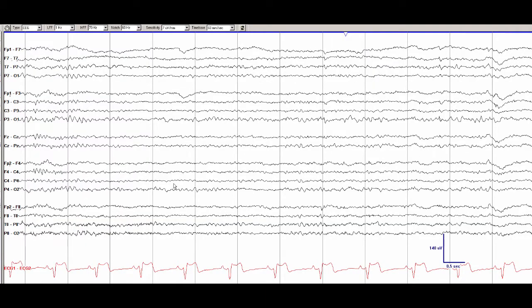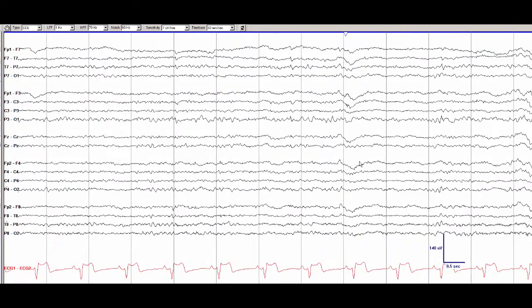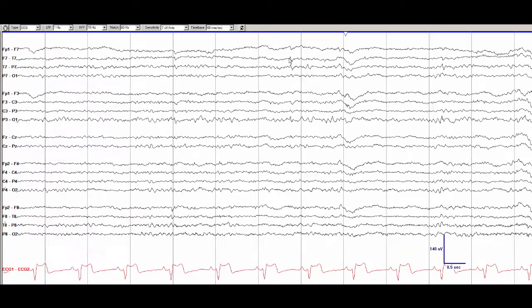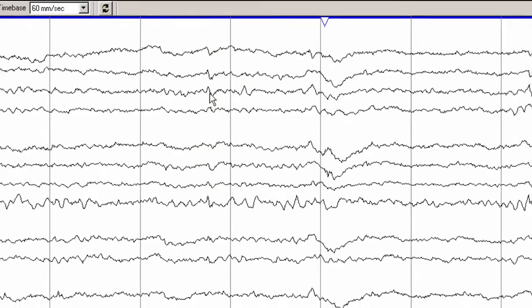Now here we see something different. You have to look very carefully and at first it is not obvious. If we move forward we can see a sharply contoured waveform in the left temporal region. It is very low voltage and short duration.